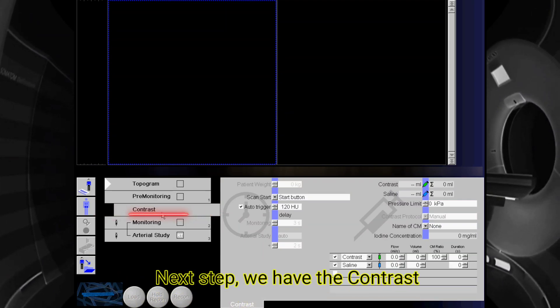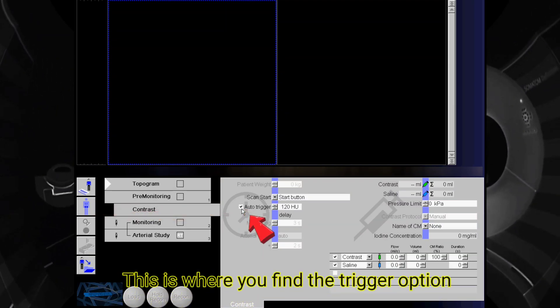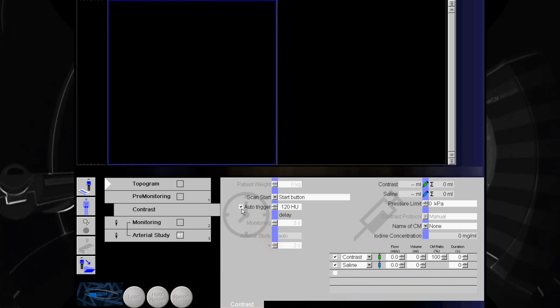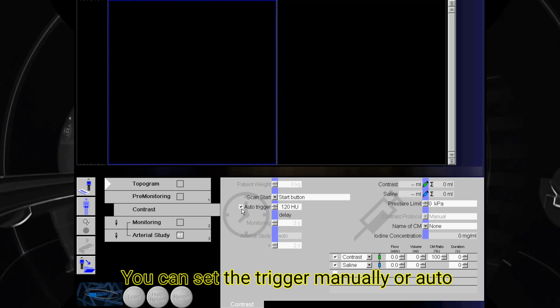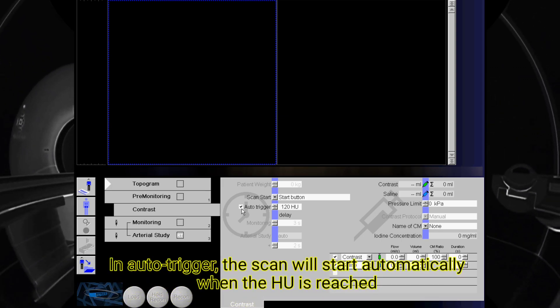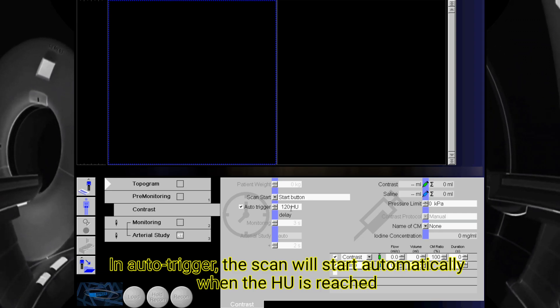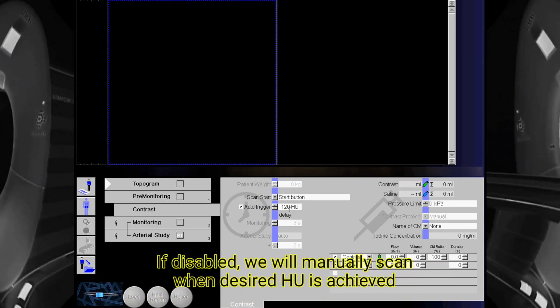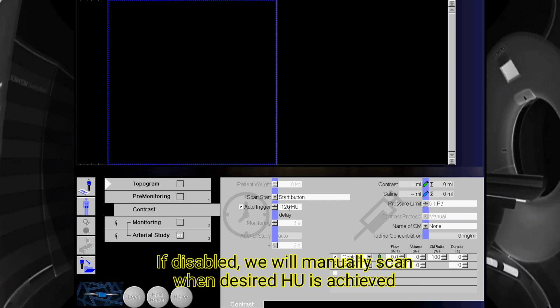Next step, we have the contrast. This is where you find the trigger option. You can set the trigger manually or auto. In auto trigger, the scan will start automatically when the Hounsfield unit threshold is reached. If disabled, we will manually scan when the desired Hounsfield unit is achieved.